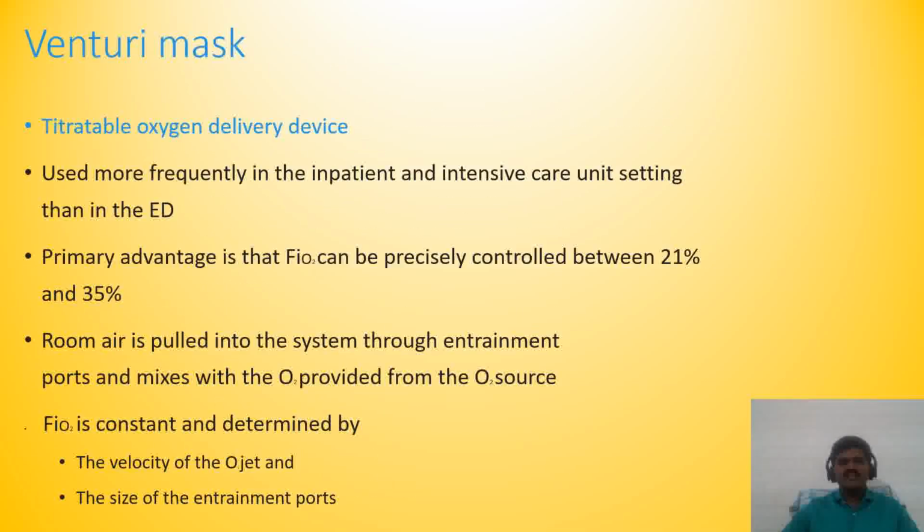The next device is the Venturi mask. The main advantage of a Venturi mask is titratable oxygen delivery, used more frequently in inpatient and intensive care unit rather than in the ED setting. The primary advantage is that FiO2 can be precisely controlled between 21% to 35%.